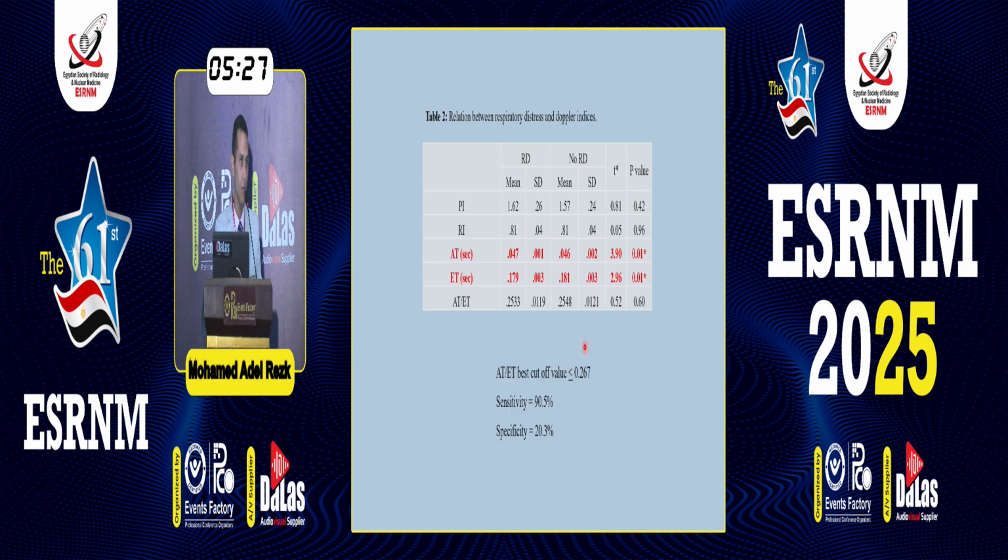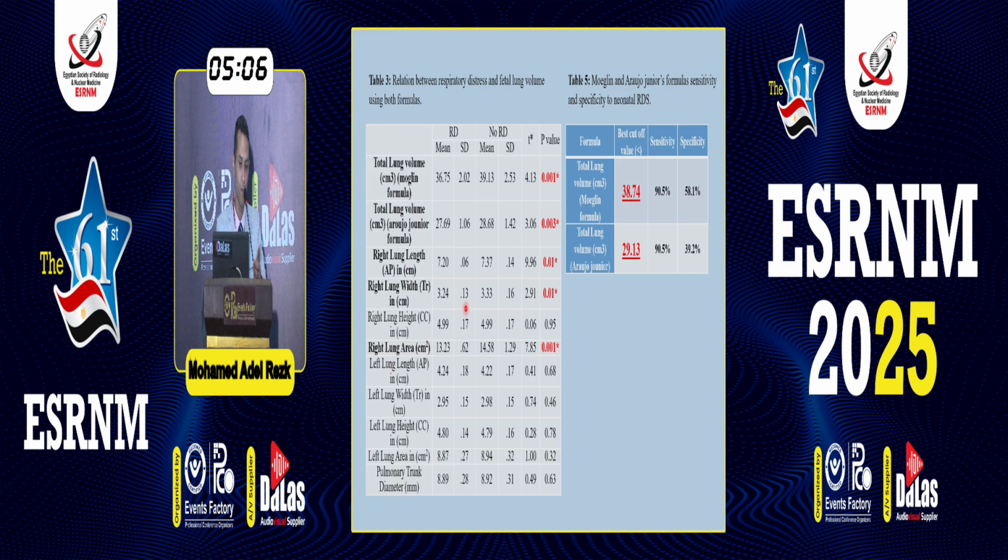Acceleration and ejection time also showed significant correlation with the progression of fetal respiratory distress, and some papers presented that the acceleration to ejection time ratio was very significant, but this really depends on the sample volume that they used.